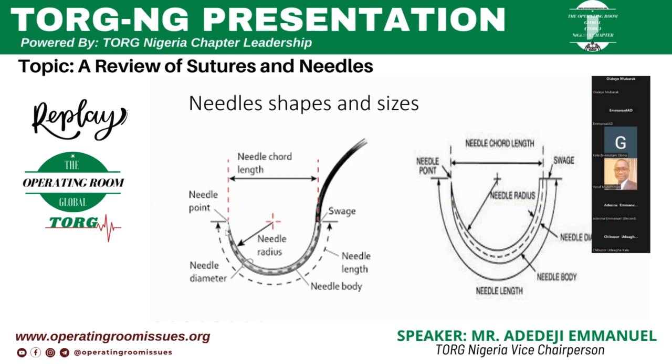Some are 3/4, some are 1/2. This particular one is half. Some are 3/8, some are 1/4. Some are 5/8. Depending on the procedure you are doing and the tissue you are considering. Of course, you cannot compare when you are doing a thin permeable or semi-permeable membrane, for example, in eye surgery, or you are doing vascular surgery.